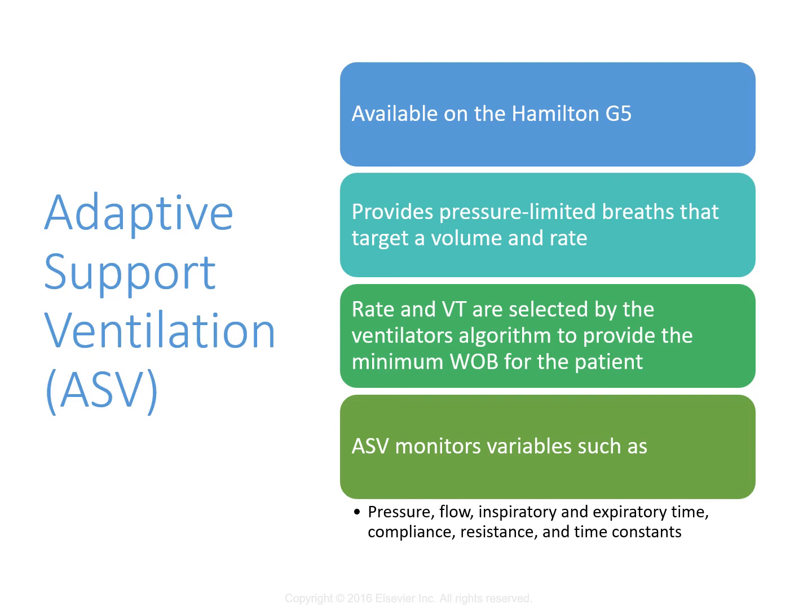But the whole point is ASV is designed to minimize the work of breathing and auto-PEEP. Right, it's designed to minimize work of breathing and auto-PEEP. So it's worth looking at ASV as an effective ventilator management strategy for patients in a variety of situations. So this one's very versatile. Post-thoracic surgery or thoracic surgery patients.